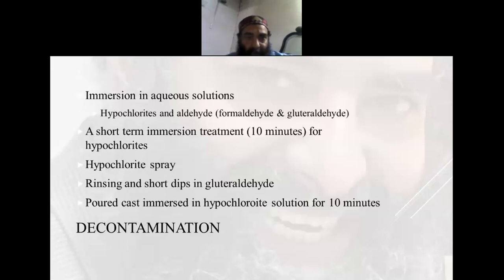Immersion in aqueous solutions is the protocol for decontamination. Decontamination does not mean sterilization, but to eradicate the harmful objects and materials from that. Immersion in aqueous solution is one of the modes.